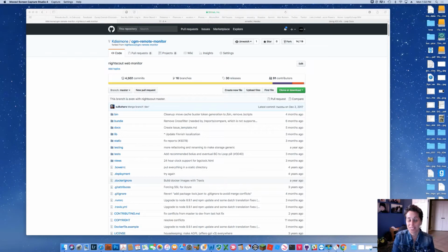Hey. Okay, so we got the basics of GitHub down in that previous video, GitHub beginners. So now we're gonna look at some ideas. I'm gonna break these out probably into smaller videos so you kind of get an idea of some different ways to use GitHub with your looping environment to make things move and flow a little better for you and possibly give back to the code if you have some ideas and you're inclined to make changes to improve for the community or yourself. So I'm just gonna start with a really basic one.